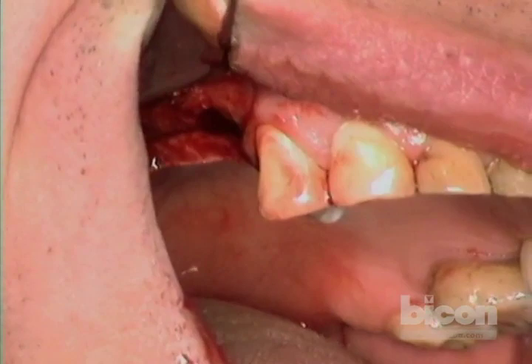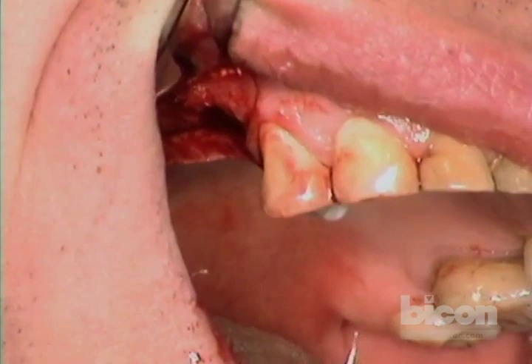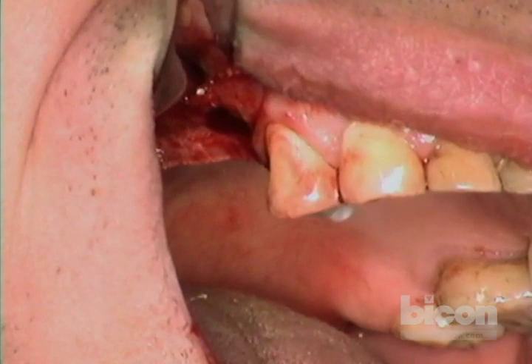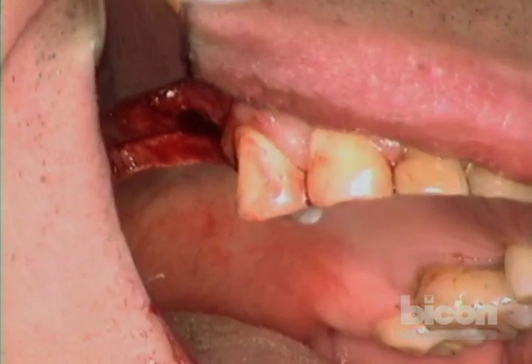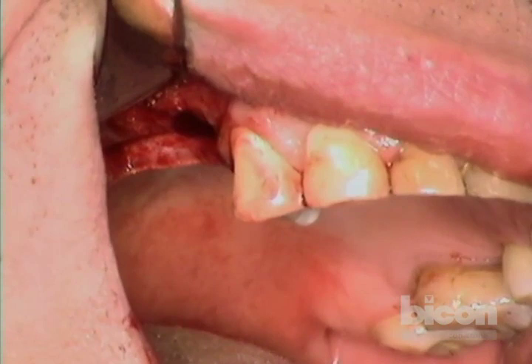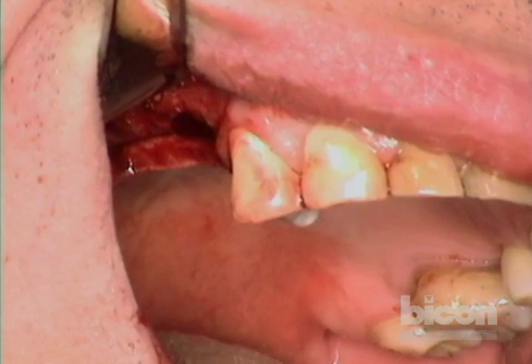I'll mix them all together to create a putty-like grafting substance and mix it quite a bit. The decision I need to make is whether to use a five by eight or five by six implant. To better show you the sinus lift, I'll use the five by eight — understand that a five by six is adequate, but the five by eight will demonstrate the lift a little more clearly.